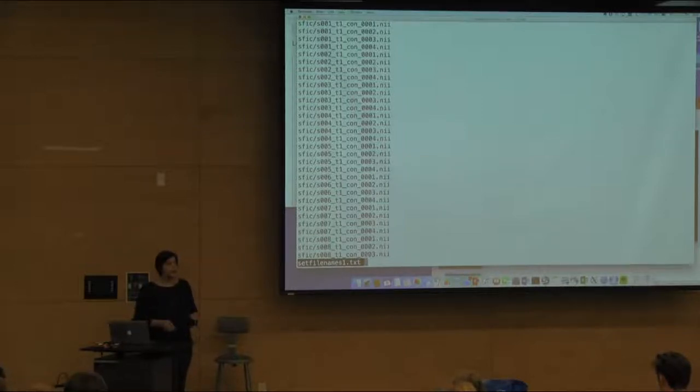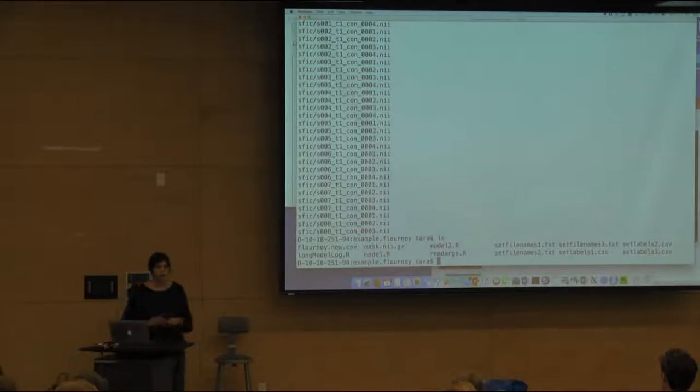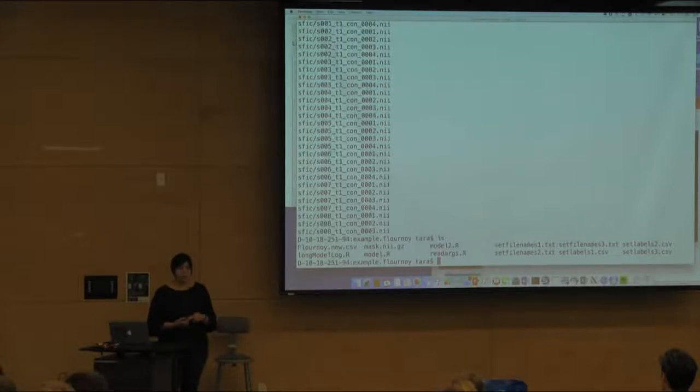And as you can see here, it's very flexible with respect to what you put into these particular lists of files. It just will simply assemble it into a structure for you, and then you can use the design covariates that you've put in, ideally pick out the contrasts that you want or compare different contrasts from the first level, and then model that in some higher level way. So a bunch of people have been using this to great success, and so I recommend that if you have, especially if you have something that is more complicated that you're trying to do with fMRI, it's worth looking into.